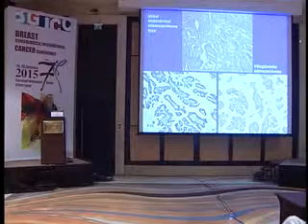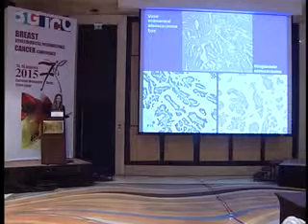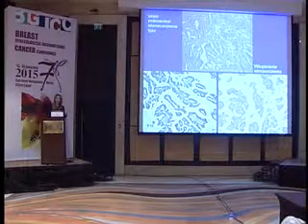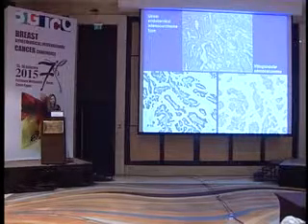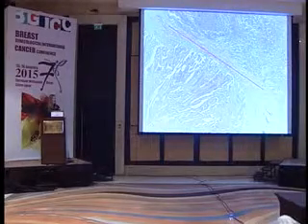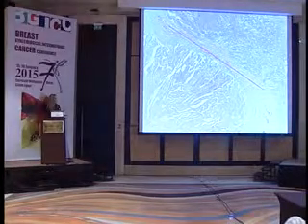This is a classic endocervical adenocarcinoma. Villoglandular, I do not give this diagnosis because it gives a false negative, I should say. It's more reassuring. I do not give it, but it's in the literature. It's a very well differentiated endocervical adenocarcinoma. Sometimes, so we call it sampling. This is a classic endocervical adenocarcinoma.